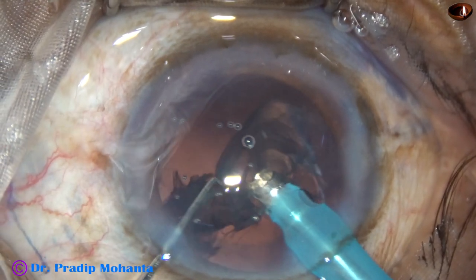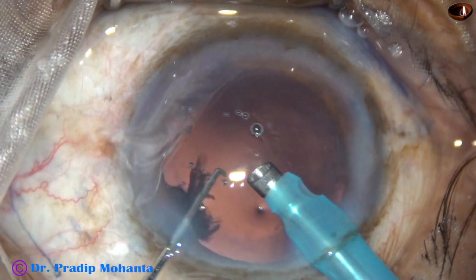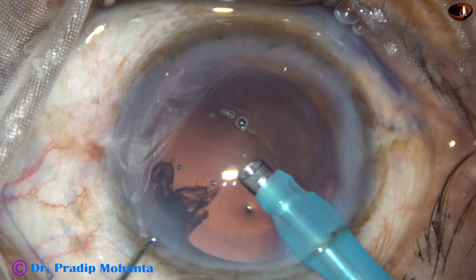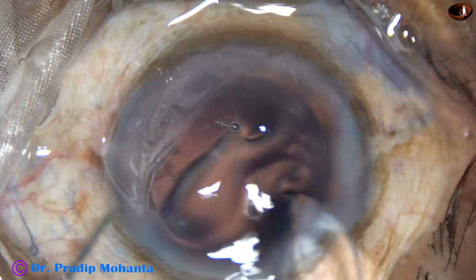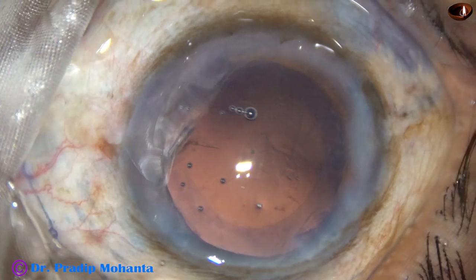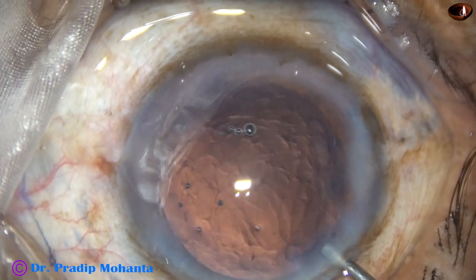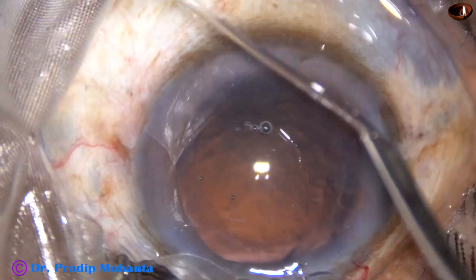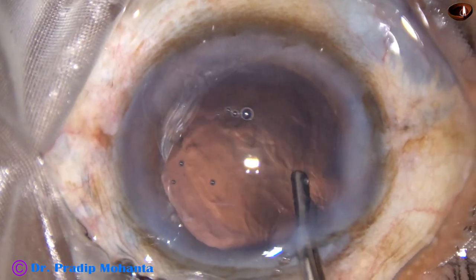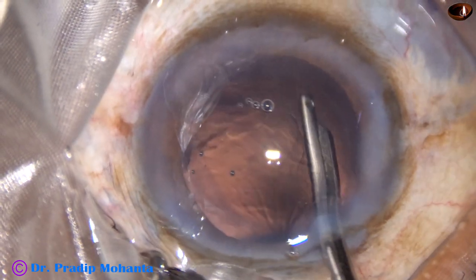The other hemi-nucleus is divided into two parts, each part then emulsified. This is the epinuclear shell — it is removed. The cortical lens matter is removed. A small bit of cortex through the side port was removed, and now some viscoelastic is injected. A 23-gauge Simcoe cannula is being used to remove the cortex.